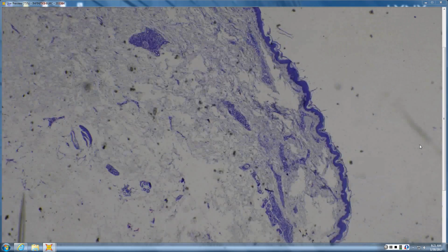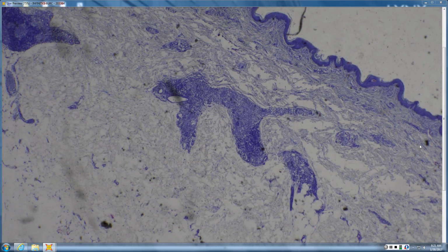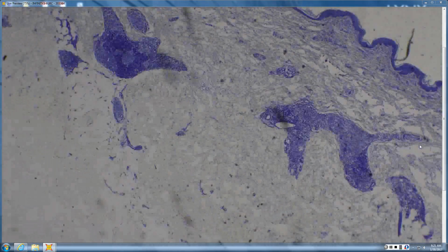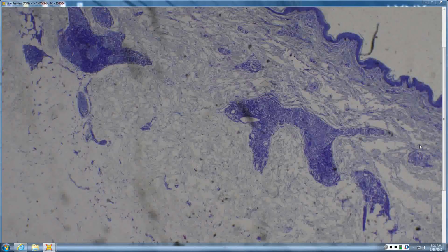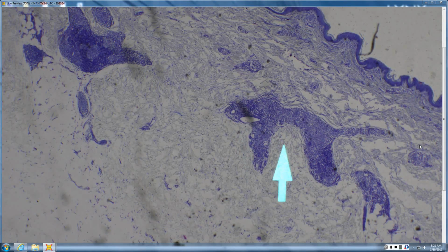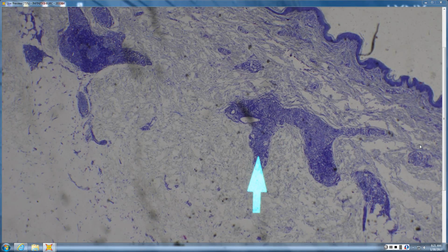Okay, so that is some kind of stain with a blue background, which could be a stain for acid-fast bacteria. Mm-hmm. And if we had granulomas, and those granulomas are going parallel to the surface, what kind of things are you thinking of? Tuberculoid leprosy. Tuberculoid leprosy. And then what if you've got lots of circles that look like there might be globi? So something that's kind of halfway between tuberculoid and lepromatous. Like borderline.